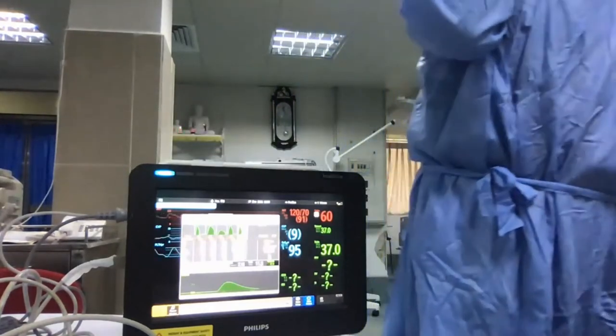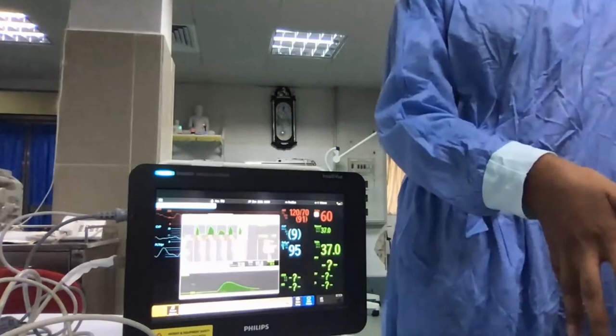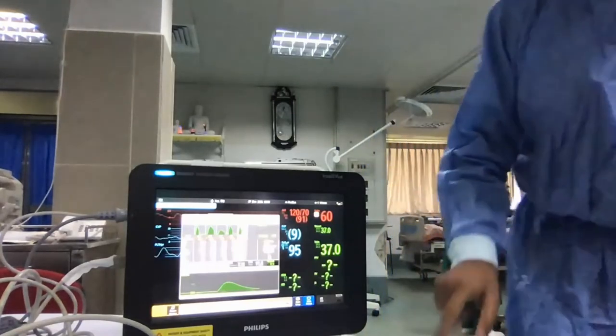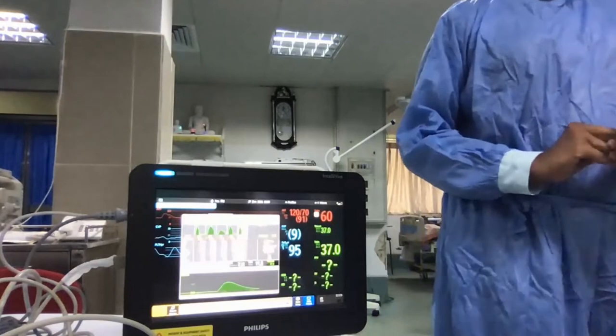That will be more accurate. Yeah, because I think our temperature may have changed. Definitely. If you can keep it in a cool box or something like that, it's more accurate. I'll do that next time. That's because we don't know whether it is at 4 centigrade. Yeah, exactly. Because it is not 0 centigrade at all. So it can be like heating.